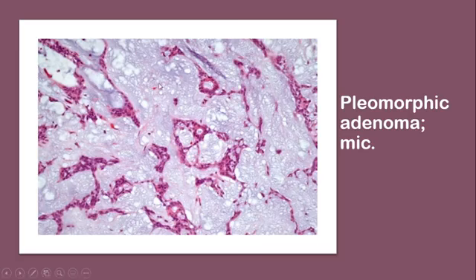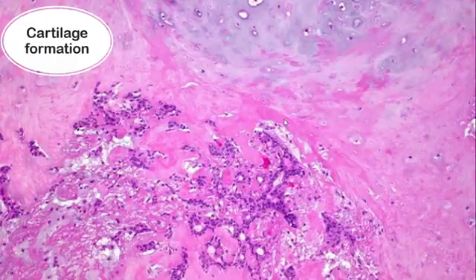Again, pleomorphic adenoma: acini, trabeculae, single cells, and islets of epithelial and myoepithelial cells. All of these neoplastic cells are benign looking, bland looking, benign in nature without malignant features, and abundant surrounding chondromyxoid stroma, basophilic discoloration.